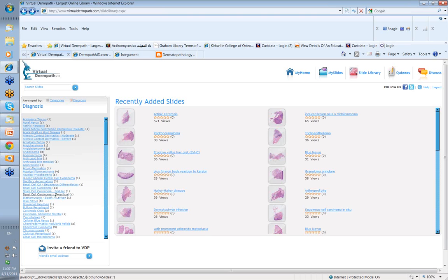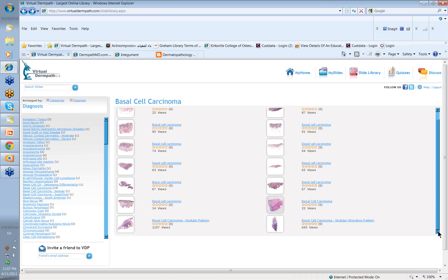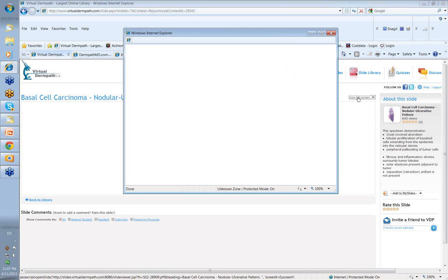Now I wanted to have a look at an ulcerating one. Here we go. Let's have a look at this one down here. And again, we'll have a look at this on full screen.